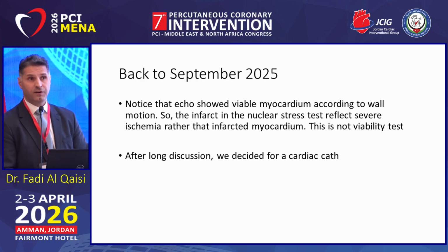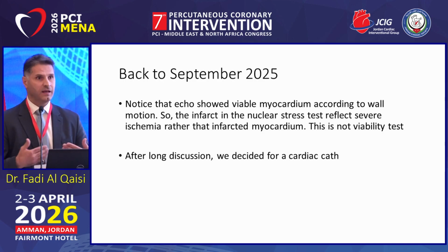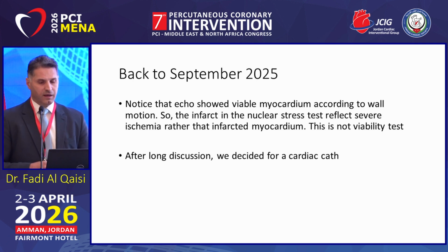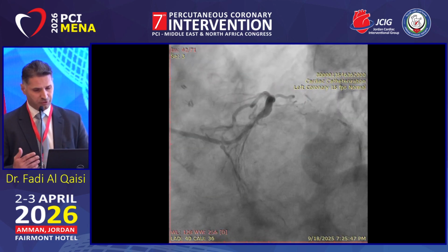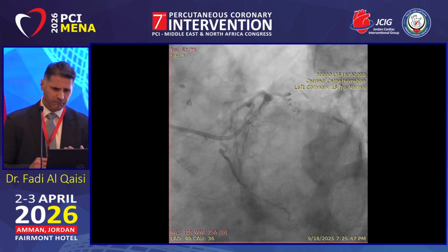So the actual infarction, I believe personally, was ongoing ischemia, even at rest. That's why the blood was not getting there, but the muscle is still alive. After a long discussion with the patient, convincing them why we are going to change the decision about doing a cath this time, they were convinced and we decided to do the cath. And this is her cath.